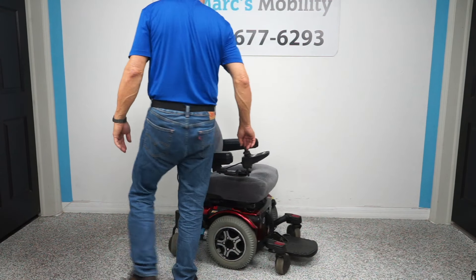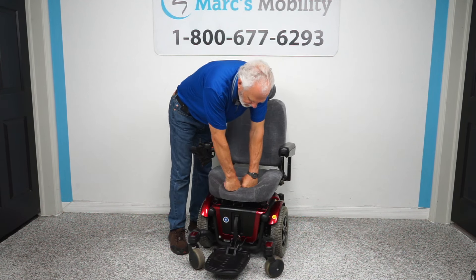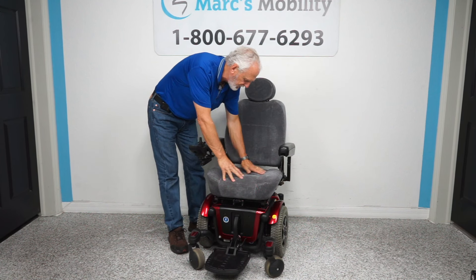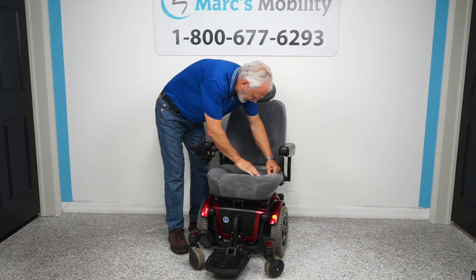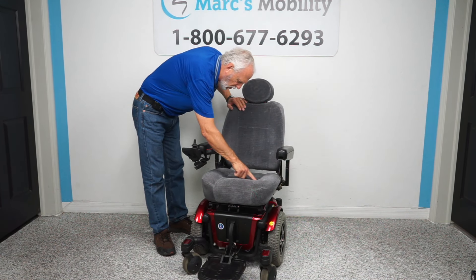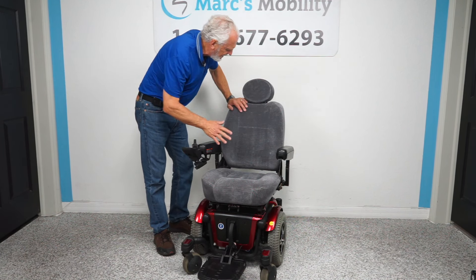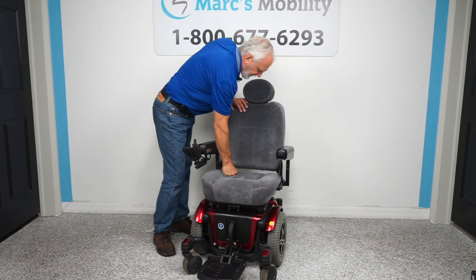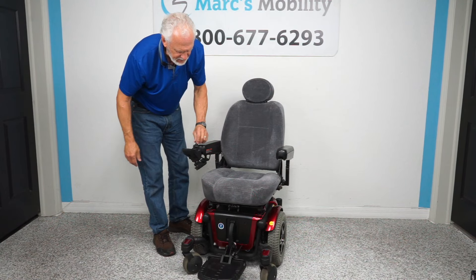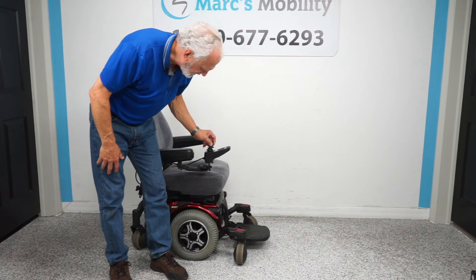The seat on this chair is 20 by 18 inches. You can see how nice it is — it's like a sofa cushion, a tweed material. There's a little bit of a seam here that's coming away, but it does not affect the seat and we're not going to fix that. You can see how comfortable the seat is. This one was used for about six months to a year at the most.